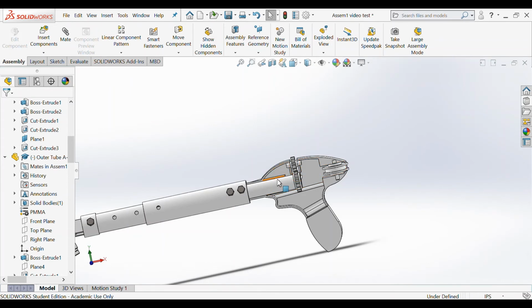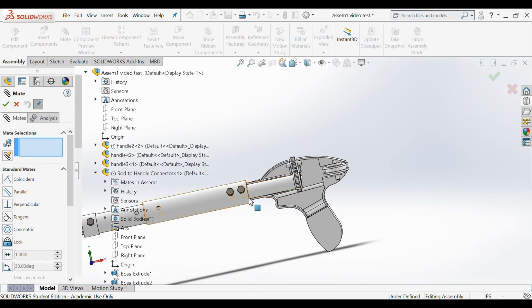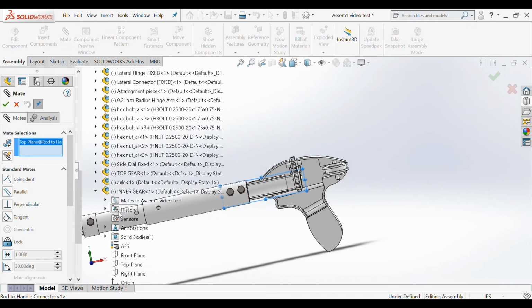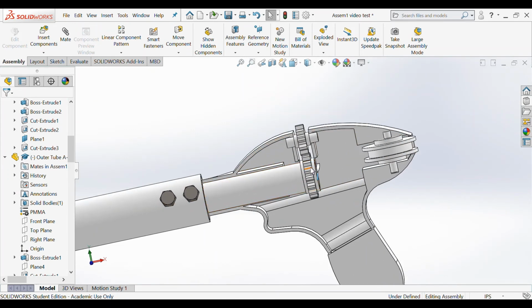So I'm going to go on ahead and mate the rod to handle connector piece's top plane to the inner gear top plane, and I'm going to make them coincident. Now this will allow the rod to handle connector piece to rotate along with the gear. So as you can see, these two pieces rotate together.